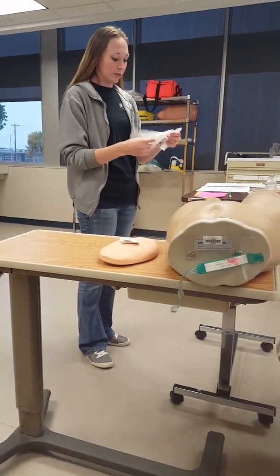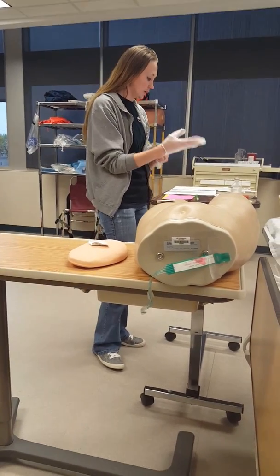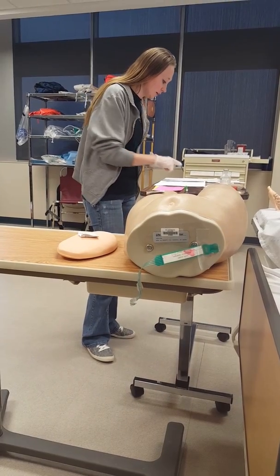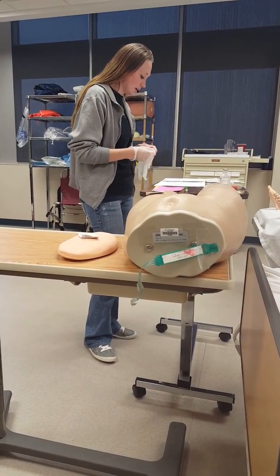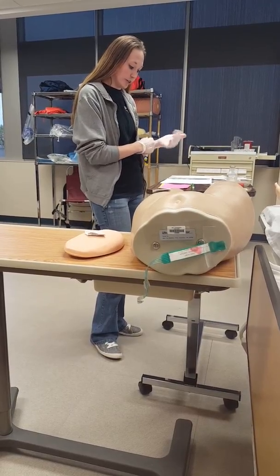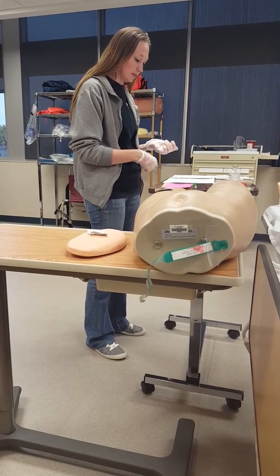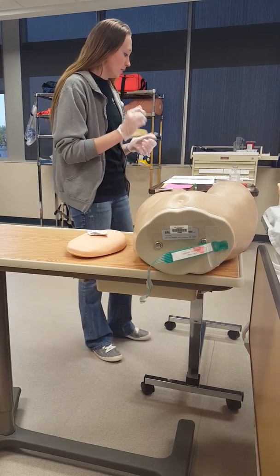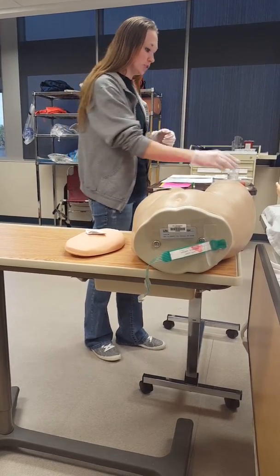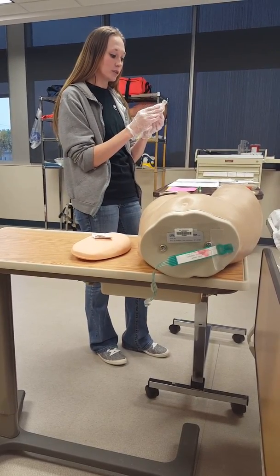And next I'm going to be giving you Novolog, and I'm going to check my doctor's orders to make sure that Novolog is on there. So, I already had checked your blood sugar, and you were at 318, so I'm going to be giving you 10 units of Novolog. Okay, so now I'm going to check my vial, and the integrity of my vial is good.